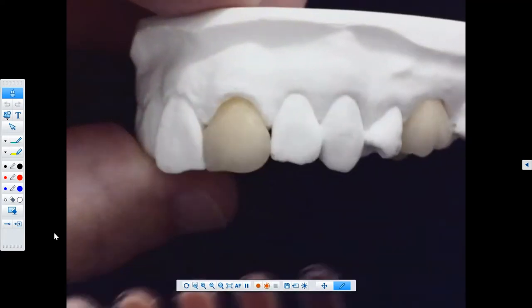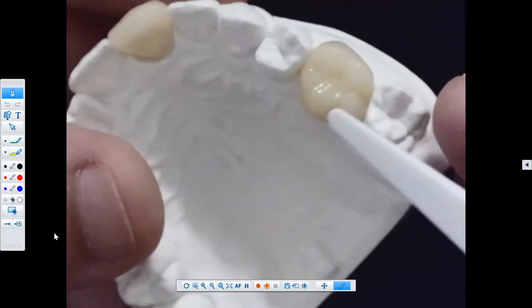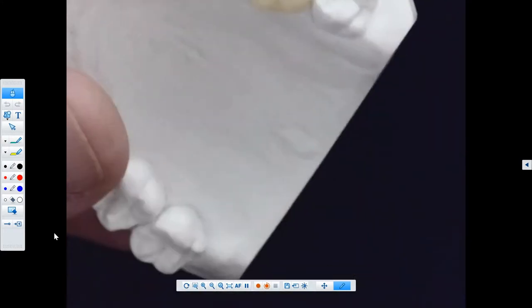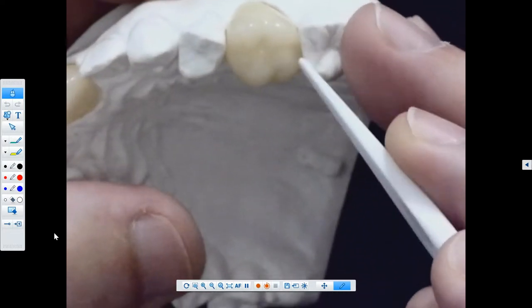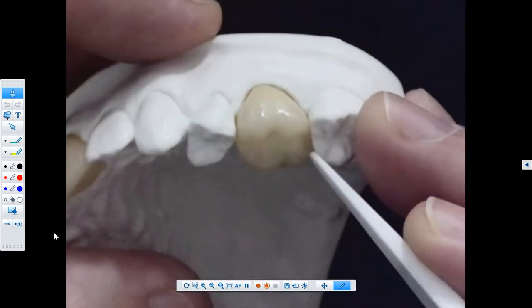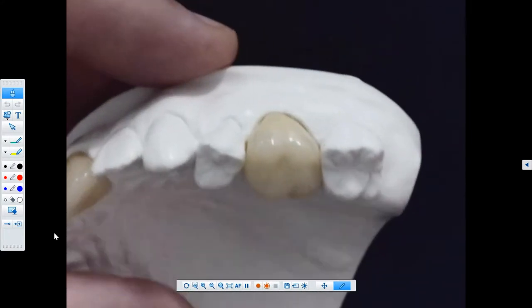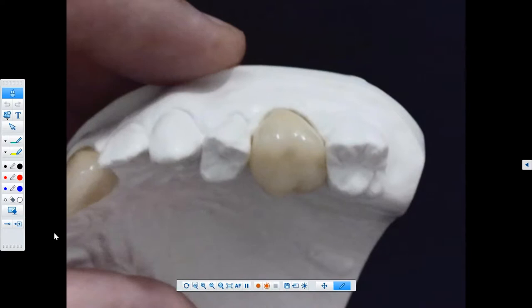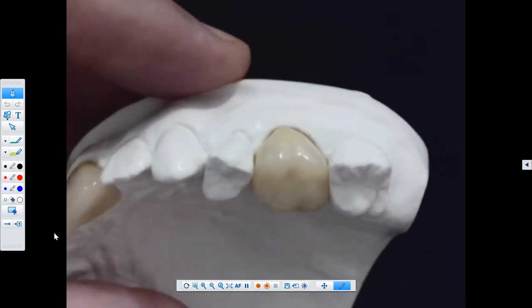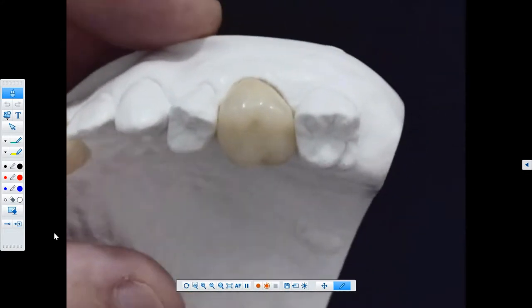If a contact is open — perhaps due to insertion axis or having to trim during seating — you can add composite to close it. You etch the area, silanate it, and add composite. Testing has shown that when done correctly the bond is more of a cohesive fracture than an adhesive fracture, meaning when stress is applied, both materials tear together rather than separating cleanly at the interface — a very strong attachment to the Enamic material.